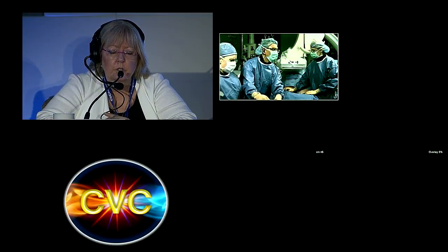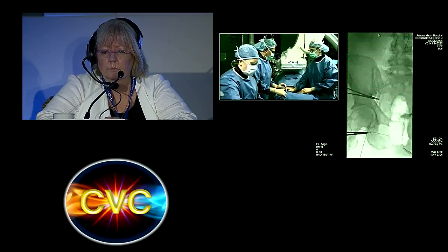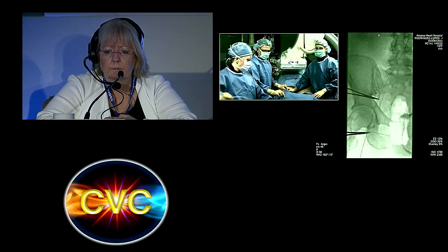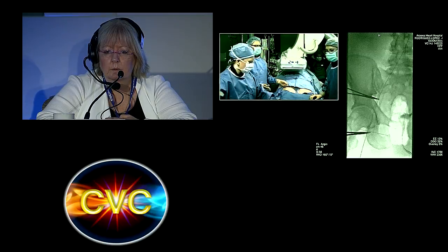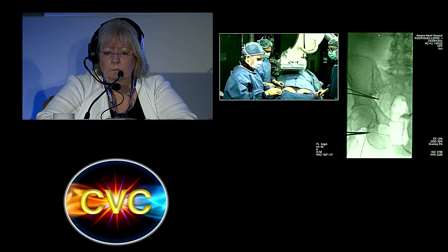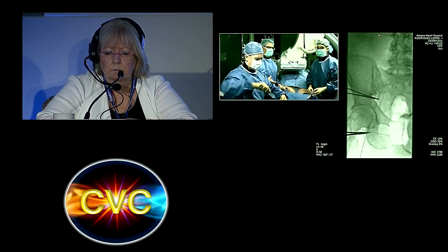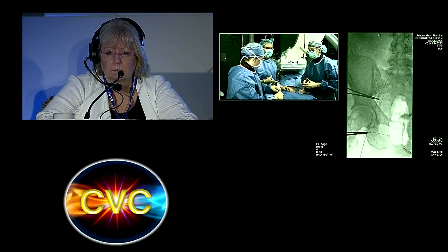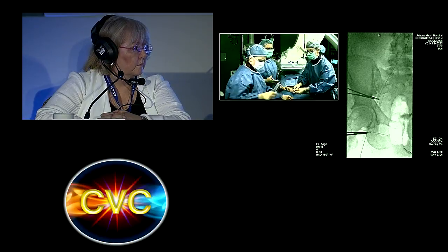You still have a stenosis of the common femoral. Does that bother you? We're going to look at that with the IVUS right now. Let's just do a quick venogram while you guys put the IVUS in. You have to remember that we started with 7 millimeter. I found that the external iliac was only 12, and we dilated with a 14 millimeter balloon. So we're going to get the measurements again with the IVUS and see what the lumen is there.